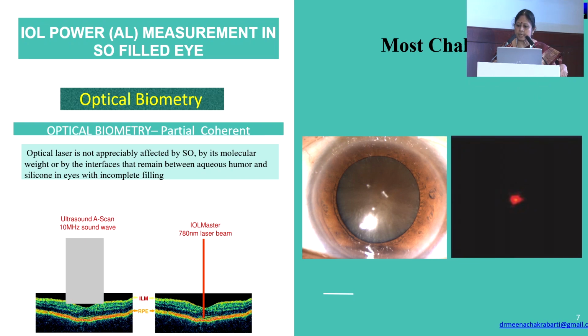However, when you have a challenging situation such as a very dense cataract, the optical biometry would not be useful because the patient will not be able to fixate at the laser target, and in such a situation, we still have to resort to using the ultrasound biometer.